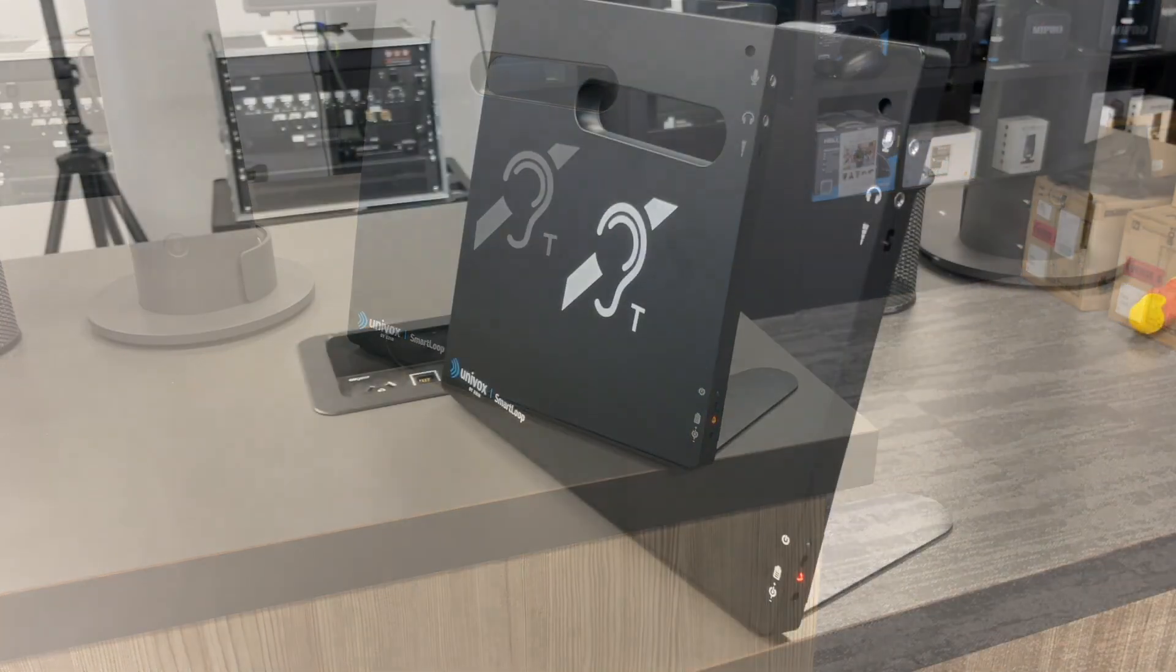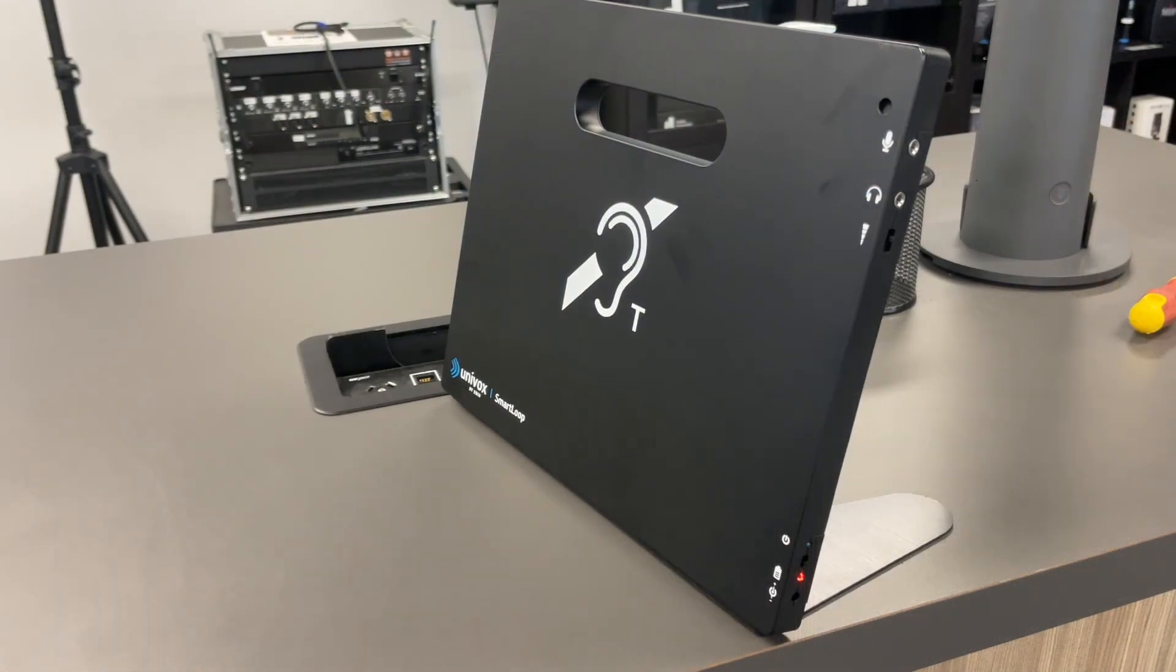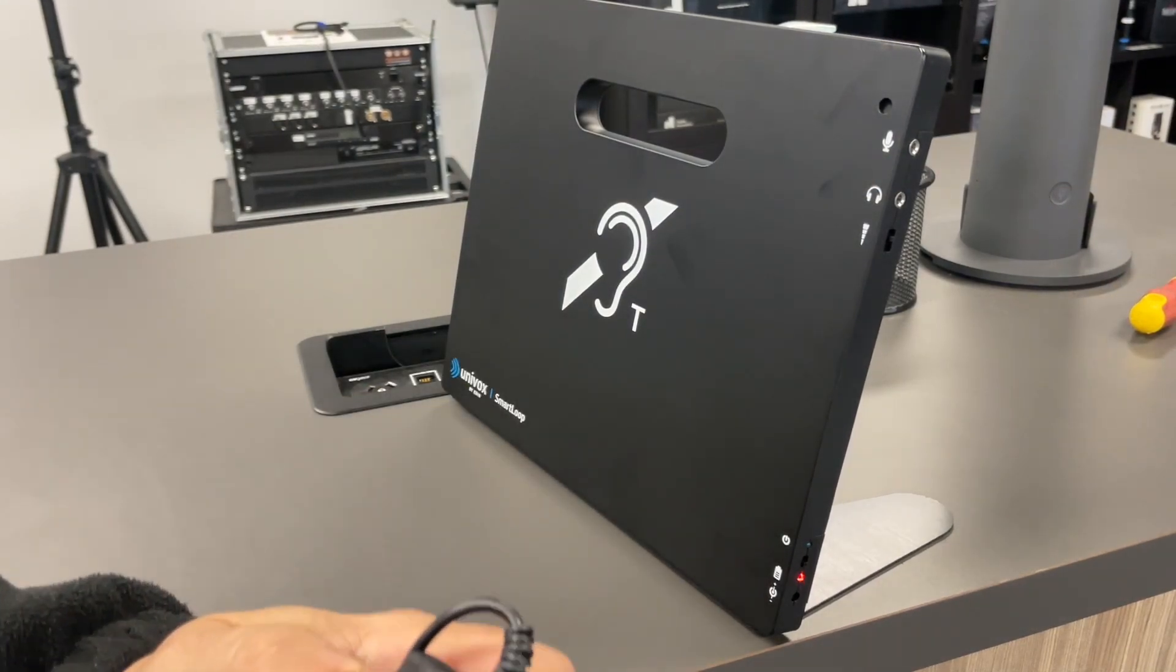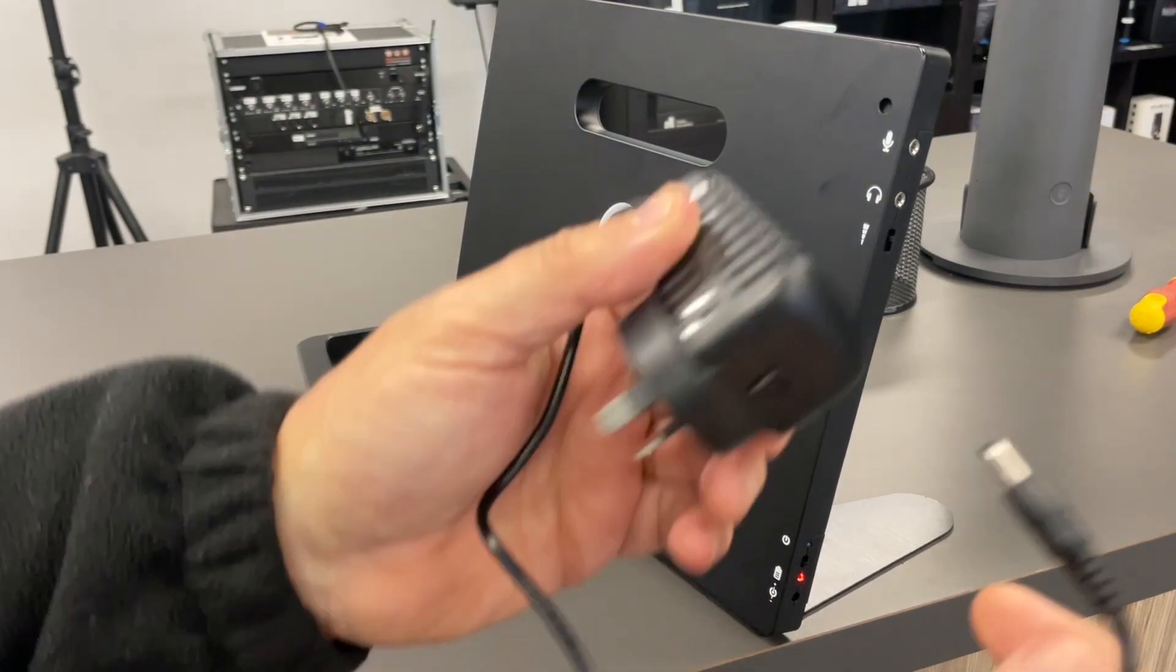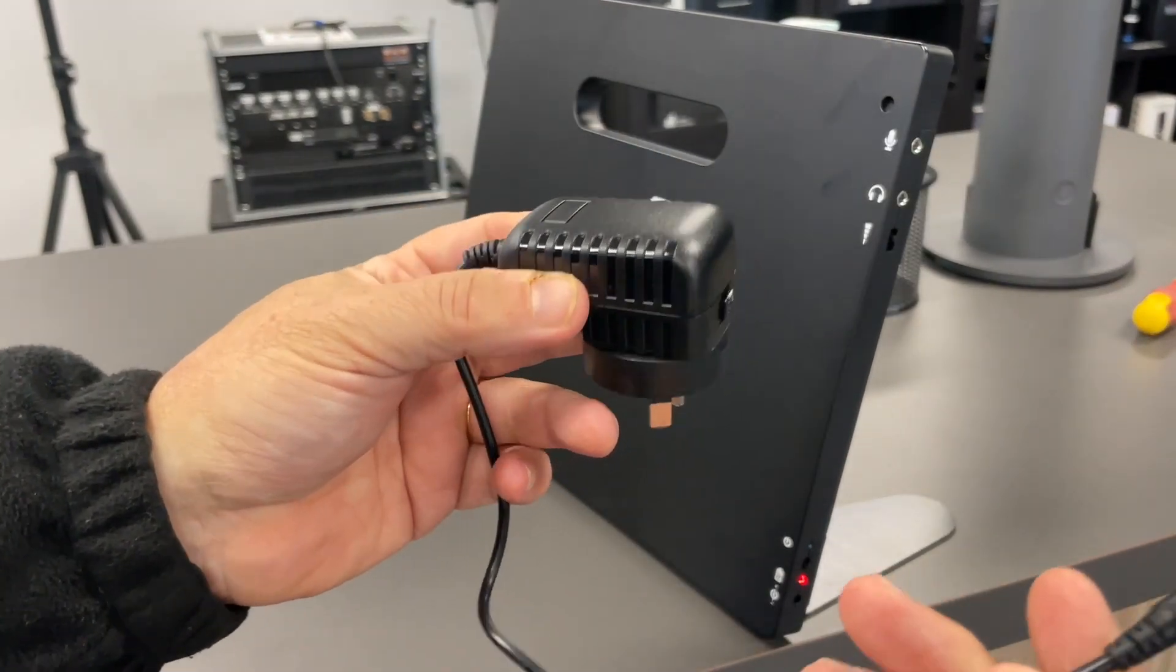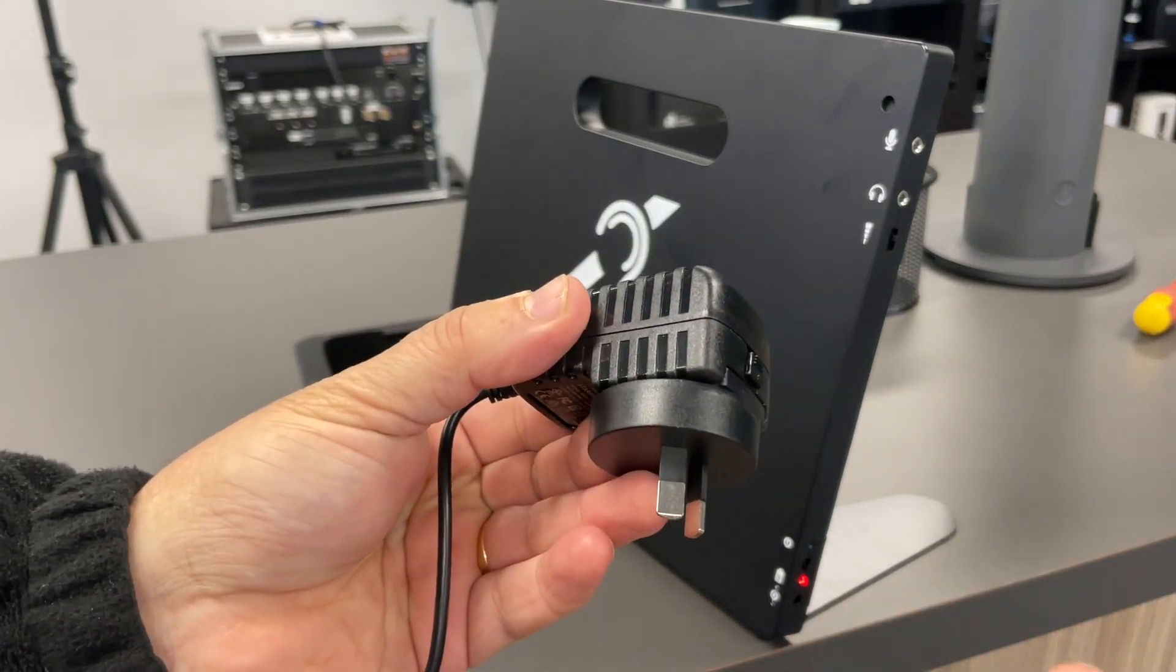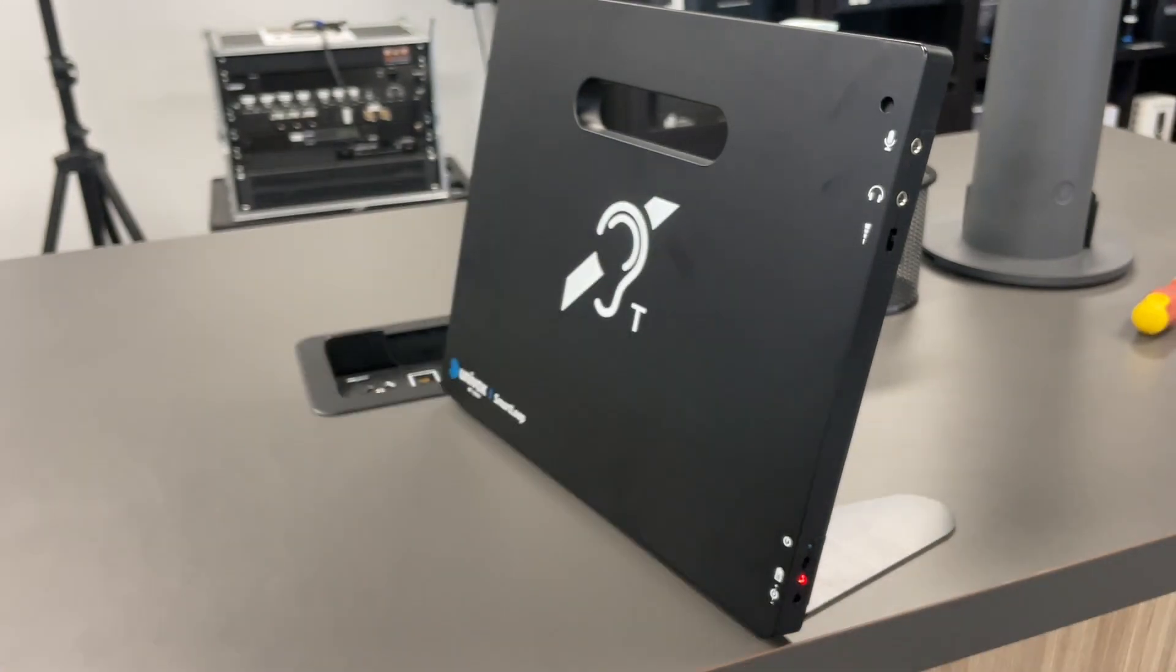It should look like that. The Counter Smart Loop can run on rechargeable power, or you can plug it into mains power with the supplied power pack, which is also used to charge the unit.